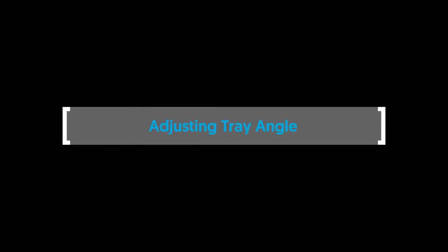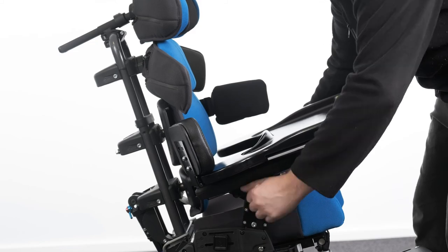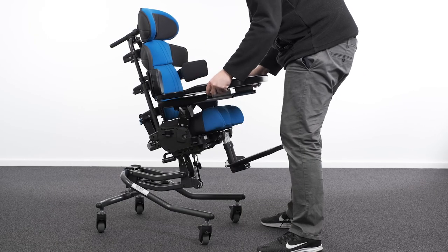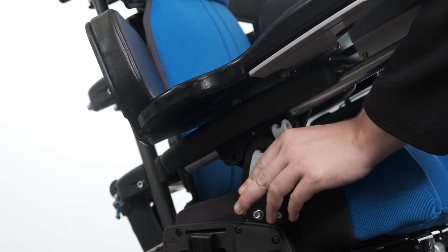Adjusting tray angle. To adjust the tray angle, locate the cam lever in the centre of the armrest. Raise the cam lever to unlock and change the angle of the armrest tray to the desired position. Secure by lowering the cam lever to the locked position.